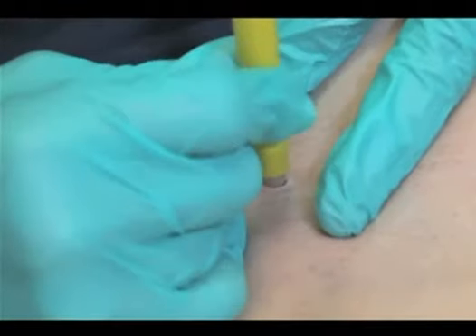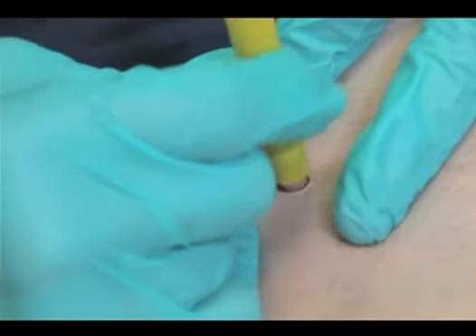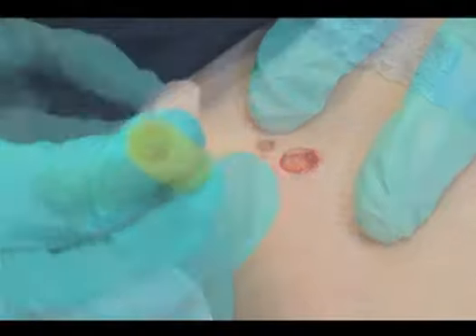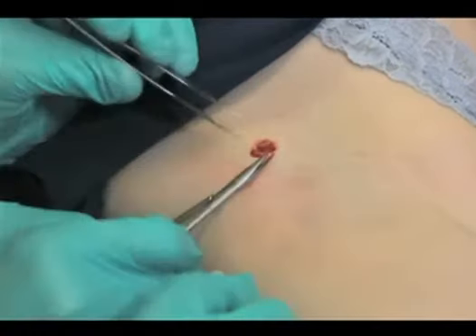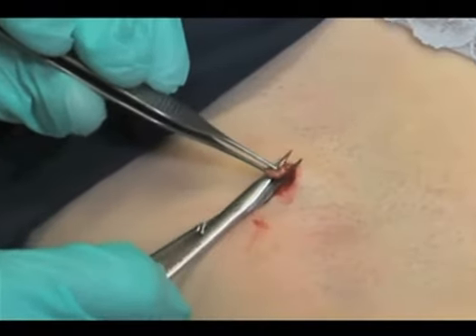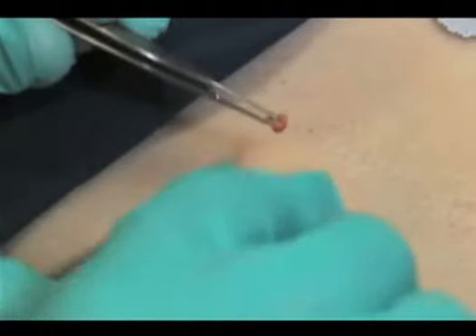Apply rotational and delicate downward pressure on the punch until you feel the give as it enters the fat layer. Withdraw the punch. At this point, bleeding may occur and require blotting with gauze. With toothed forceps, carefully grasp and lift the specimen, taking special care not to crush it. Use scissors to cut out the base of the specimen at the level of the fat.